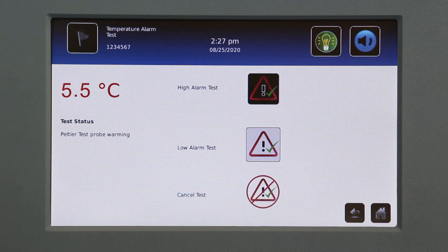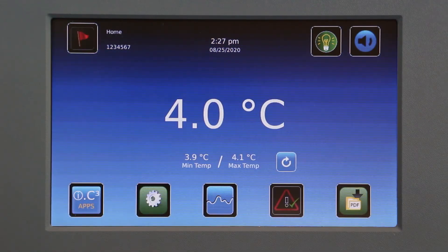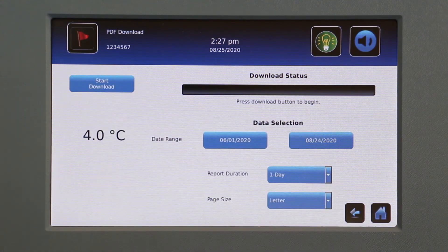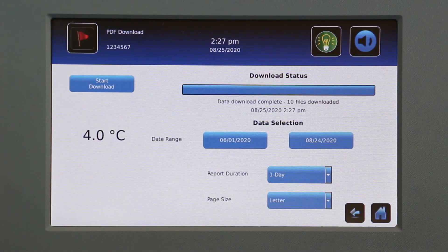When completed, the test result is displayed in the Test Status section of the display. Download the event log for an electronic record of the test. The temperature at which the alarm sounded is included in the event log.